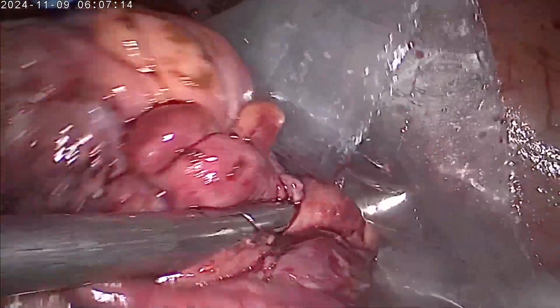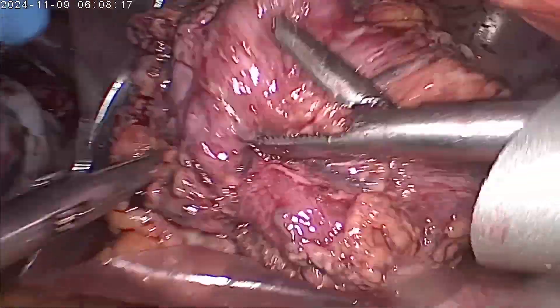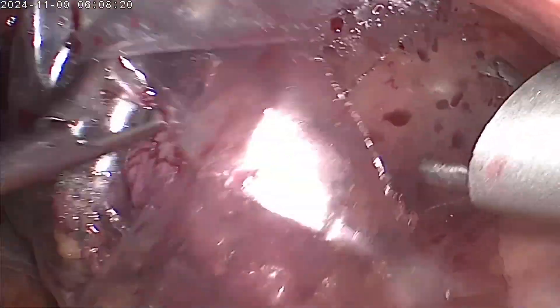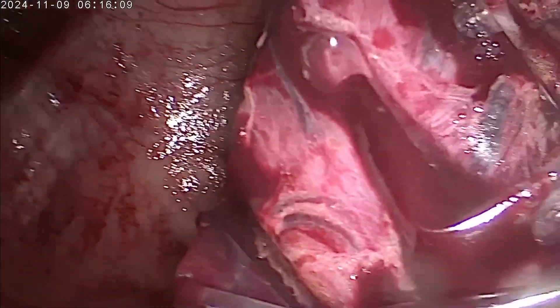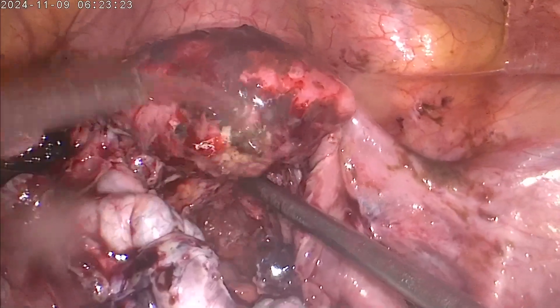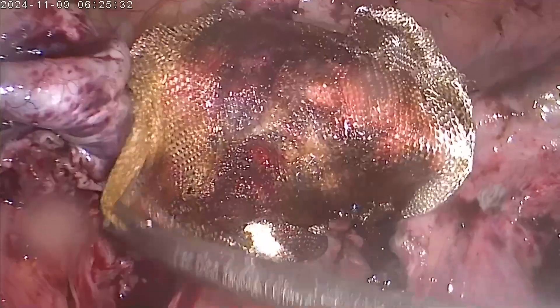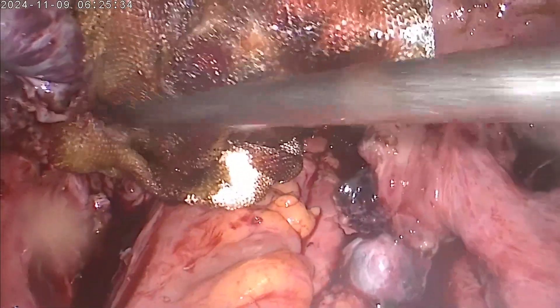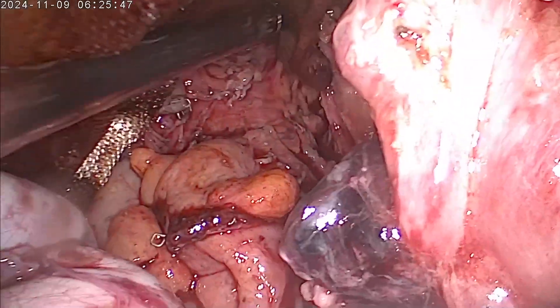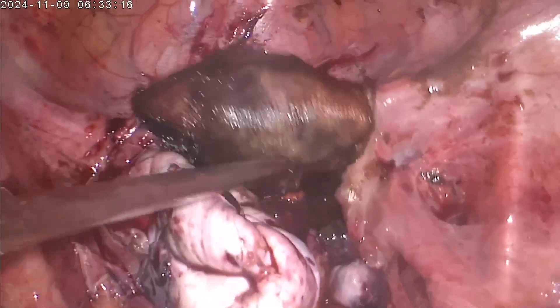The bowel specimen is loaded into an endobag and retrieved to the 12mm port. Finally, we place an interseed to hopefully prevent further adhesions within this area. And this completes our procedure.